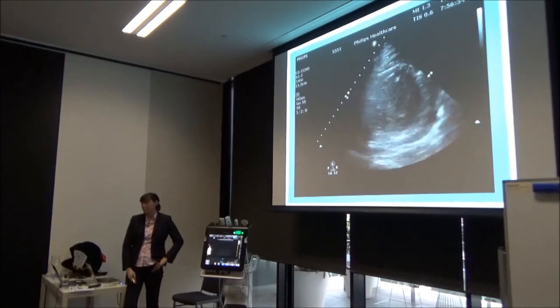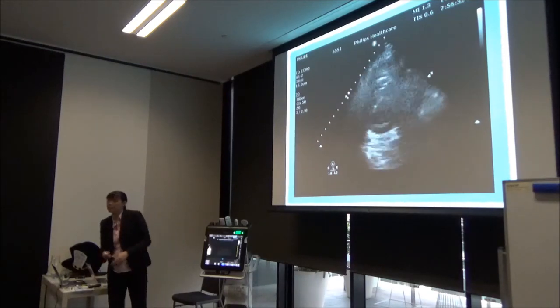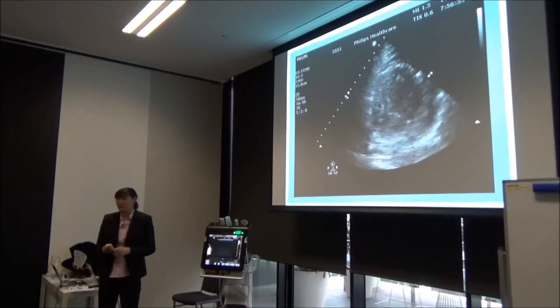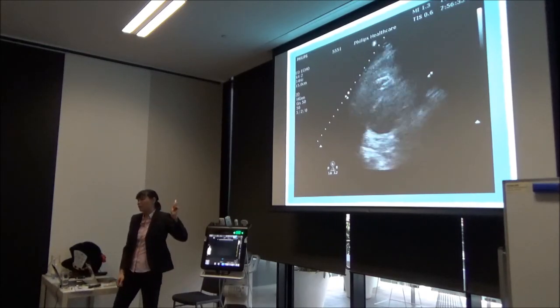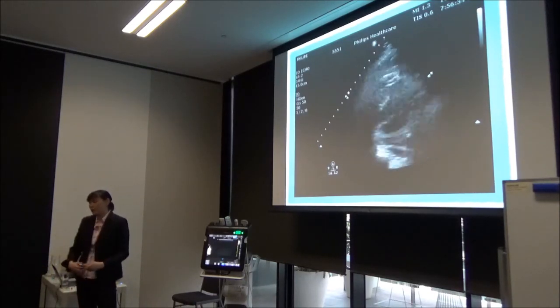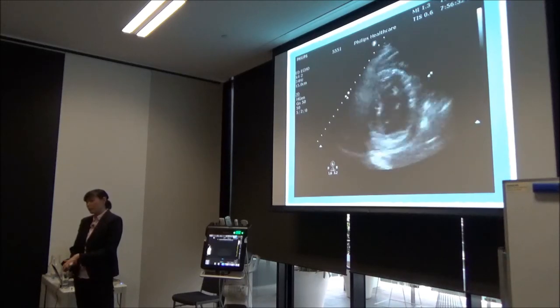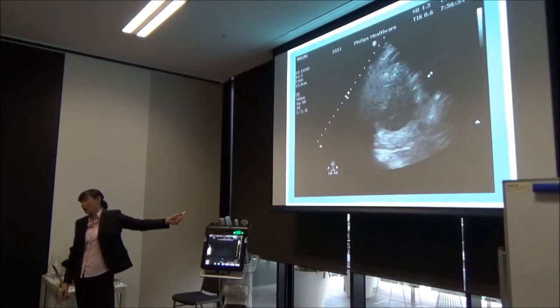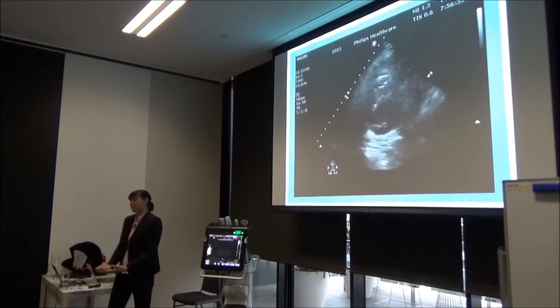Feedback? Adequate? No. What would your feedback be? Slow down. Slow down. So this is actually happening with the paramedics who are on scene with you when they're dropping off the patient. Before they even take their hands off, I'm doing this so that we can try to provide continuous monitoring of their CPR.